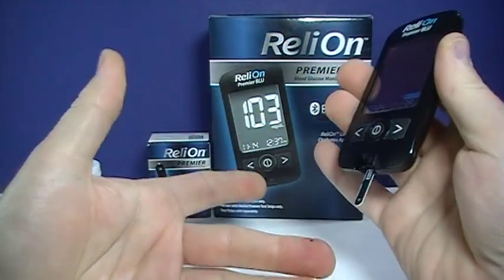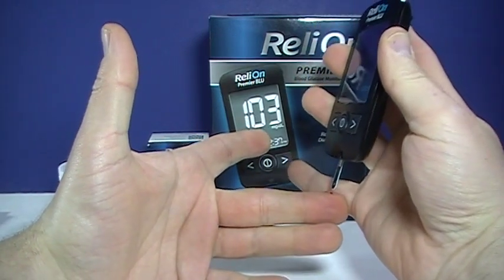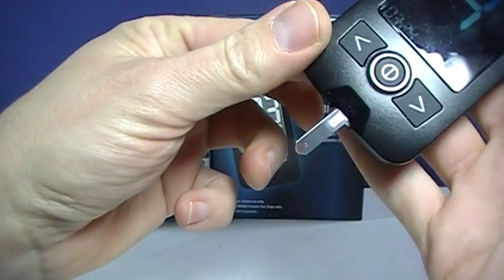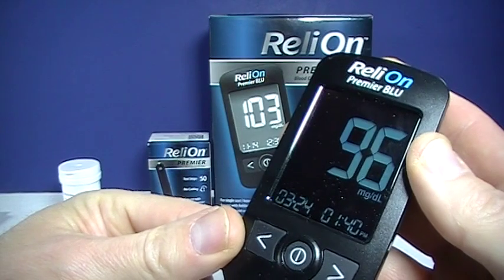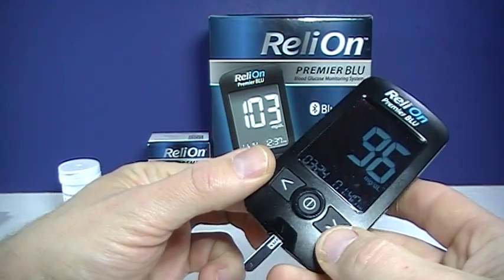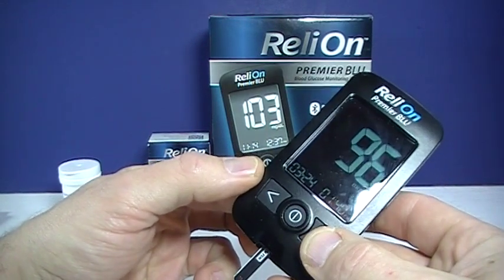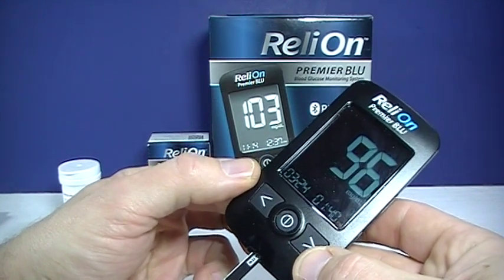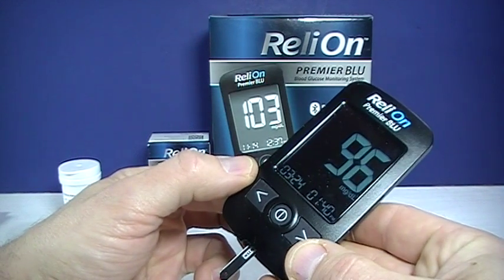So we have a drop of blood there. We want to put that strip at a 90-degree angle to that drop of blood. And as you can see there, that little window turned red. Then our reading right there is 96. Now at this point, we can code that reading. We could put a full apple for before eating, half apple for after eating. That symbol means fasting, and then the last symbol is a control strip.